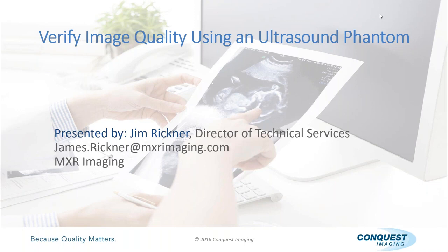Our senior engineer actually did a really good job, not coincidentally, he'd been in the ultrasound industry for 25 years. Our junior engineer, on the other hand, had made some assumptions on how to use a phantom that were completely inaccurate. So part of this is an effort to build some consistency throughout the imaging community on how to use a phantom to evaluate image quality. So that's where we're going today. Please, if you have any questions, speak up. It's a very informal lecture. The more questions, the more we all learn.